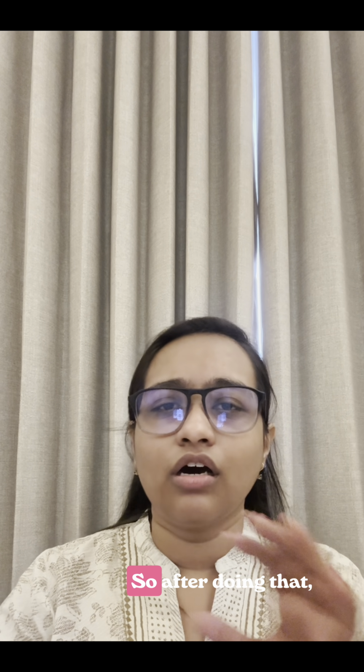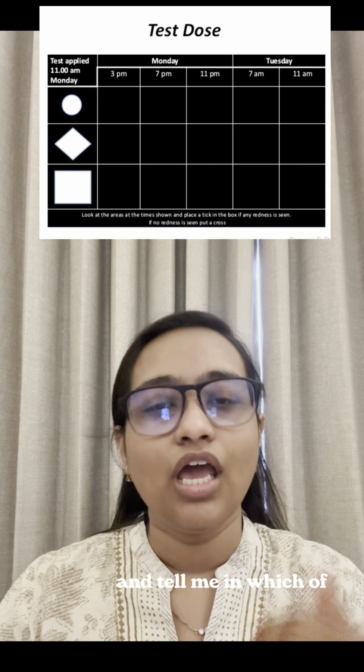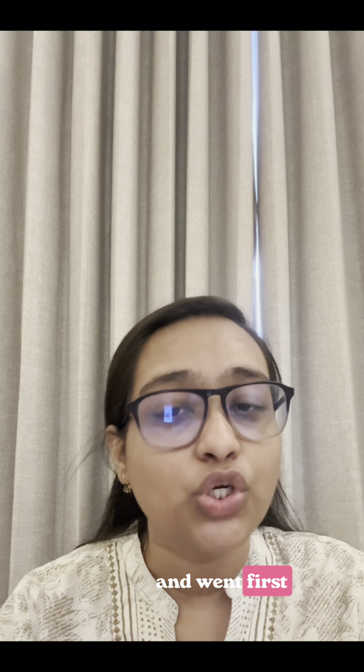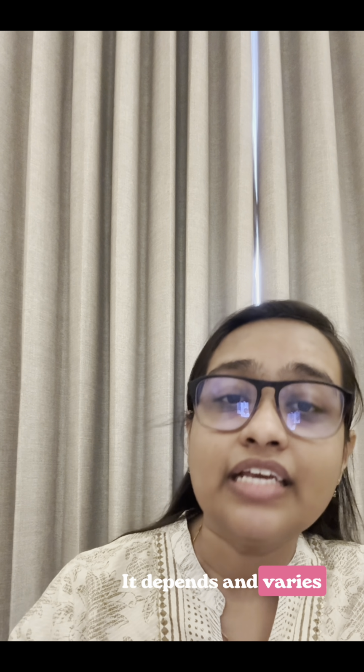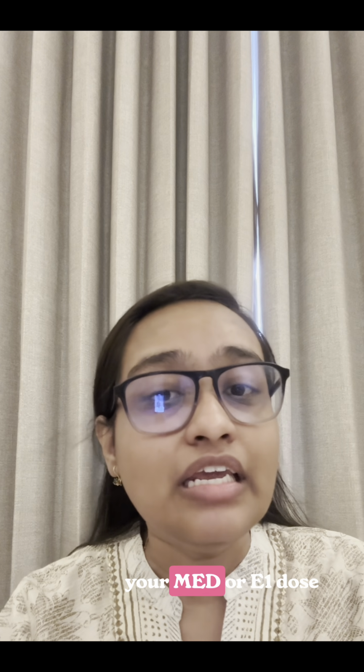After doing that, you give a card to the patient where all the 3 shapes are there, and you tell the patient, go home and tell me in which of these shapes the redness appeared last and went first. The next day the patient comes in and says the round was the shape where the redness appeared last and went first, so that will become your E1 dose, or specifically your E1 time. That could be 2 minutes, 5 minutes, or 10 minutes. It depends and varies according to the patient. It is never the same for every patient. So that is known as your MED or E1 dose.